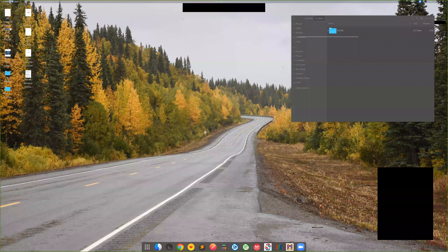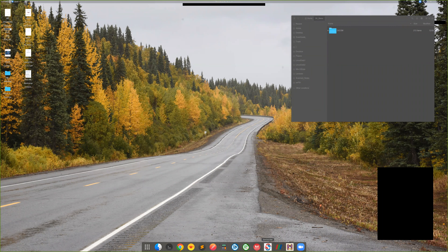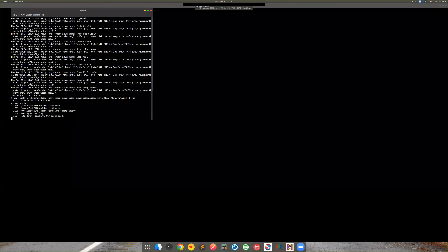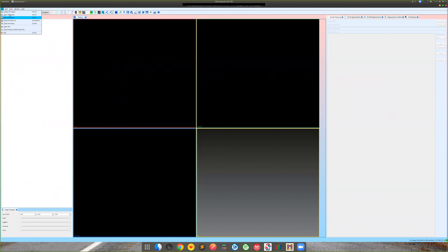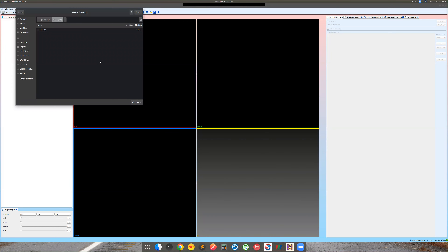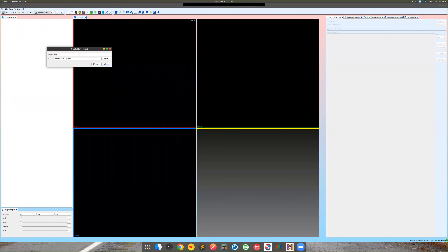Today we're going to learn about the 3D segmentation tools in SimVascular. The version I have is from April 6th, 2020. We start with creating a project — let's create a temporary project called 'sv_test'.